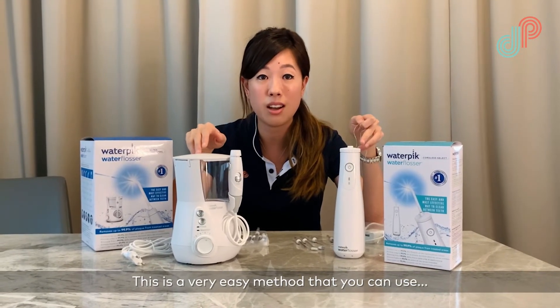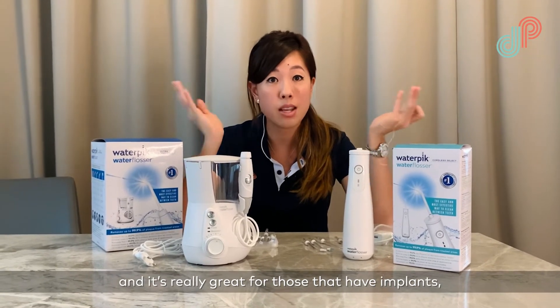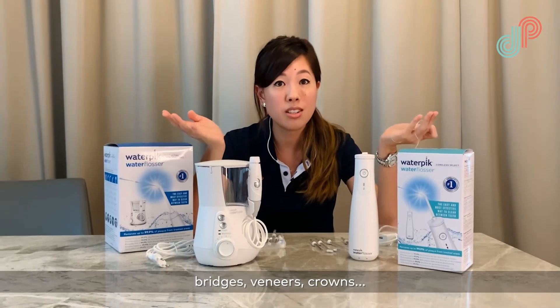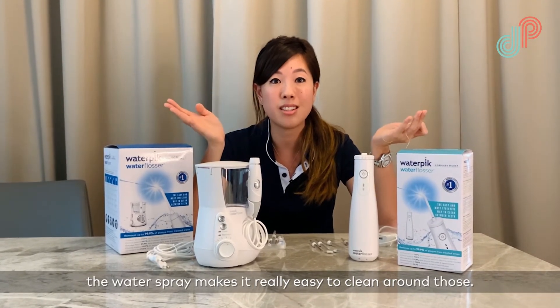This is a very easy method that you can use, and it's really great for those who have implants, bridges, veneers, or crowns — the water spray makes it really easy to clean around those.